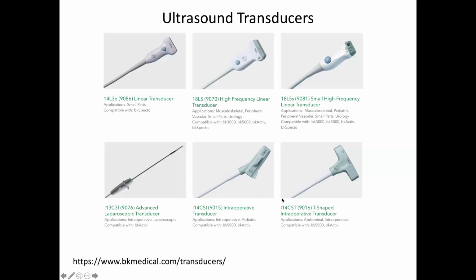So ultrasound is used, and when we get to applications, I'll try and look up some great papers and videos on using ultrasound to direct ablation therapy, if you're trying to ablate a tumor locally, and biopsy guidance. A couple of students from my lab, right after they graduated, joined Philips and led a team to develop an ultrasound guided biopsy machine, in which they had these biopsy tools with balls off the end, and they had cameras.